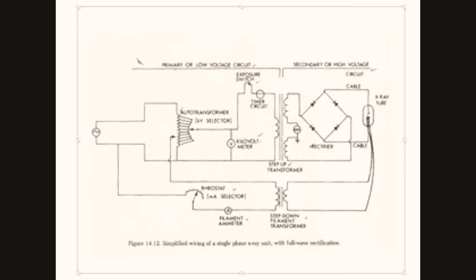Our next part of the X-ray circuit, the exposure switch. So pretty much the exposure switch initiates the exposure, and it's kind of like an emergency switch. They call it a dead man switch. This is a safe way to avoid overexposure. And with that, we have the timer. This essentially is the portion of the X-ray circuit that is crucial to determine how long the exposure extends and terminates the exposure. It is important to choose the right time of the exposure to avoid overexposing, of course.